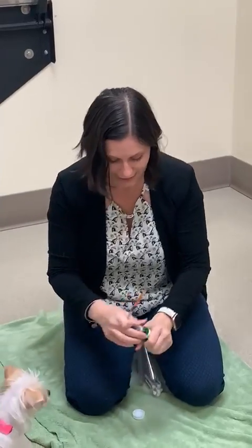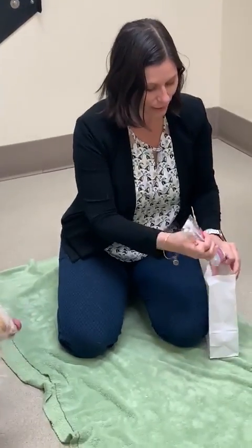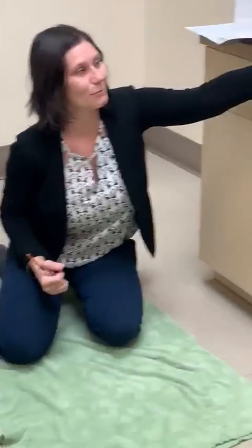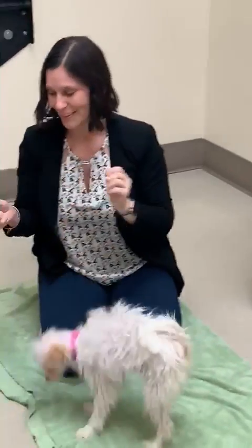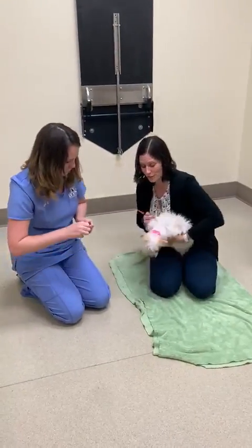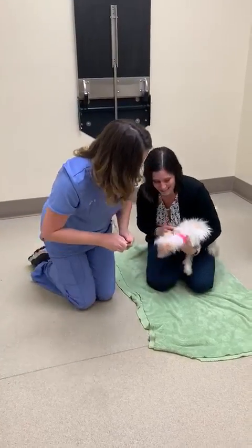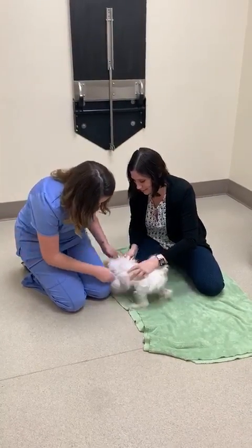So once we have that pulled up and ready, put that back and out of the way so our little helper isn't going to help us with that. She is an active little puppy, so if you have issues with them being very active, you can use things like bribery, like treats. If your dog is getting B12, they might actually be getting it for a medical reason, so check with your doctor — make sure it's okay to give treats if you're going to do that.